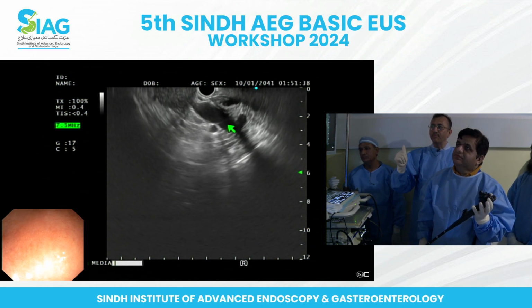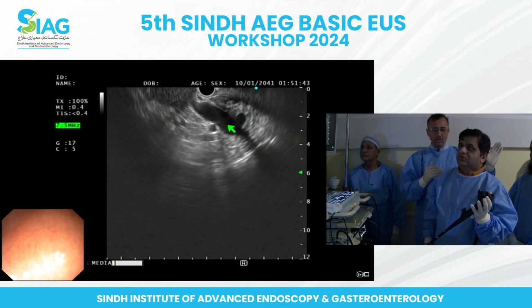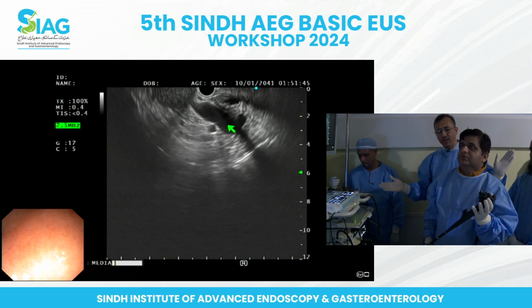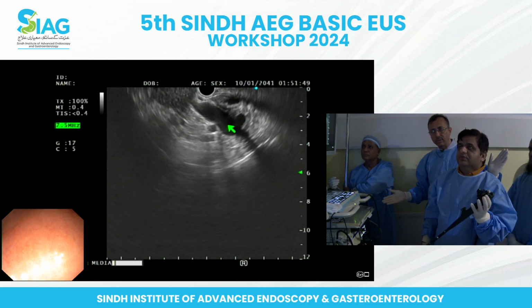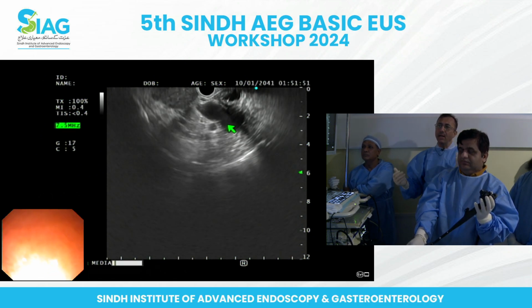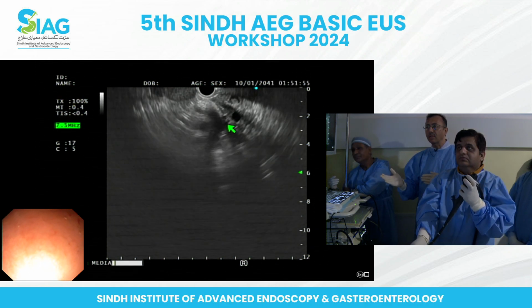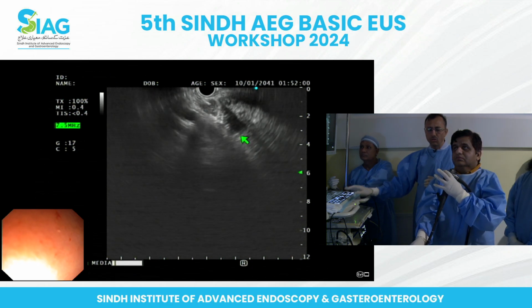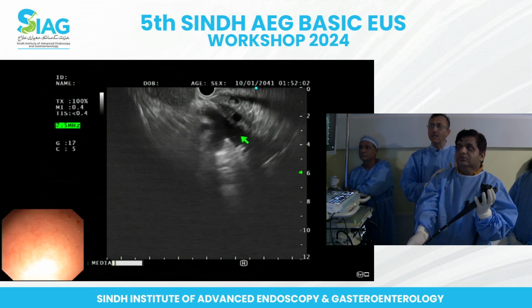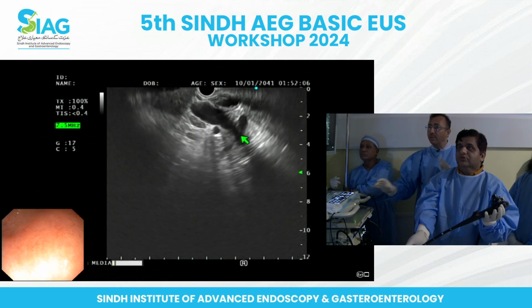Once you have identified the portal vein, next is the CBD towards the liver, counterclockwise, and from the portal vein, the pancreatic duct is clockwise, meaning back to the right. So tip up and clockwise rotation, you are going to go towards the pancreatic duct, and you will be able to identify it. Slow. Again, your movements are in centimeters. It has to be in millimeters, right?